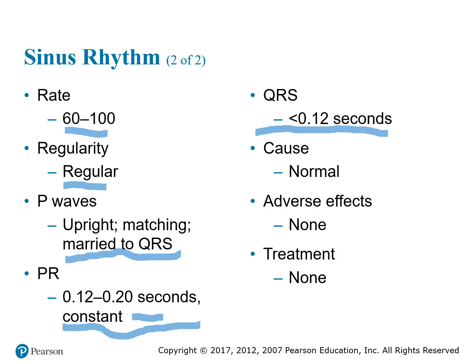This is a normal rhythm, so there is no underlying cause that will cause this. There are no adverse effects because this is what it's supposed to be doing. And there is no treatment based on this criteria of what you see here. They would not treat any of this because this is a normal rhythm. This is where everybody should be.